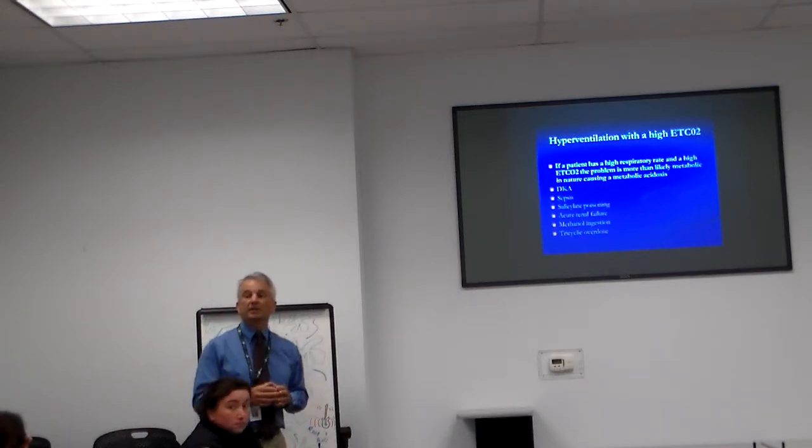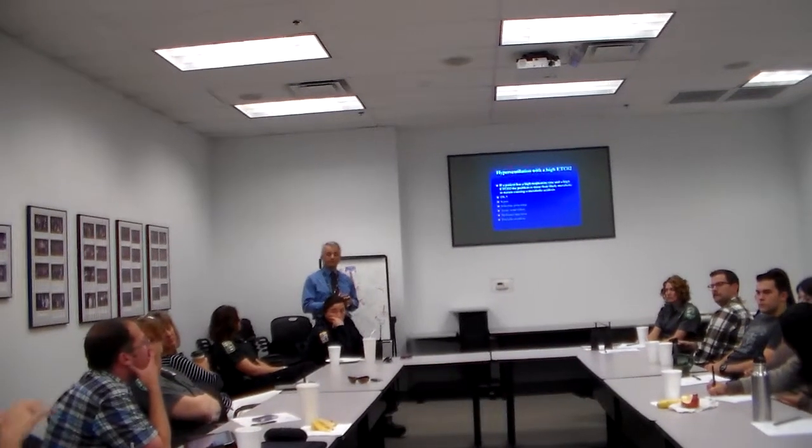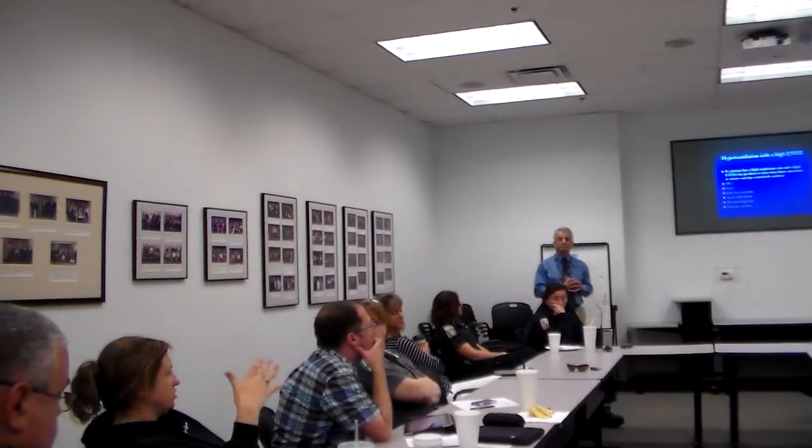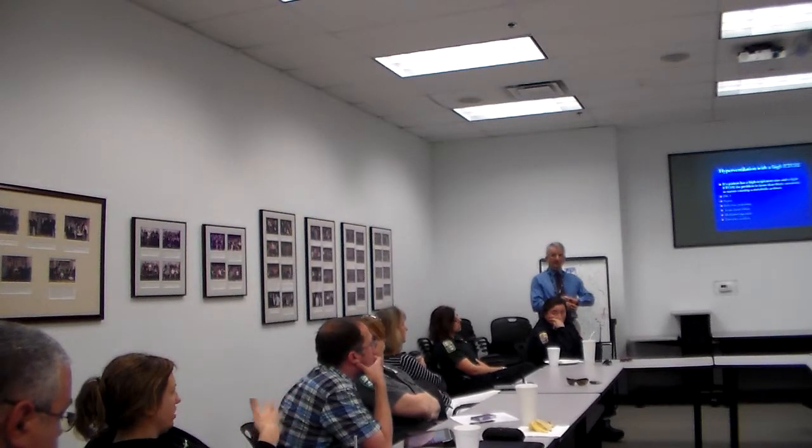So, yeah. Jenny? Someone who's just hyperventilating for anxiety reasons, you're obviously going to see a high respiratory rate, but what would you expect to see their CO2 levels be, because they're not septic or anything? They're going to have a low CO2 because they've blown off so much.